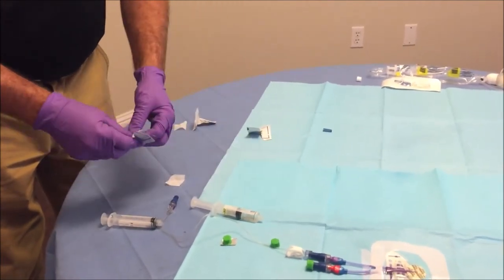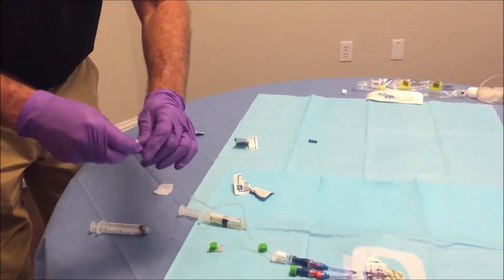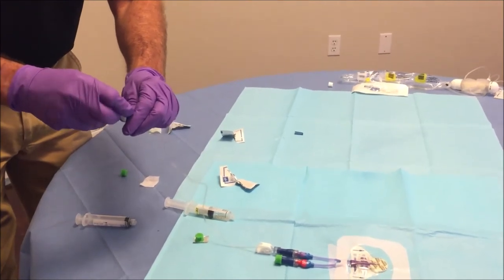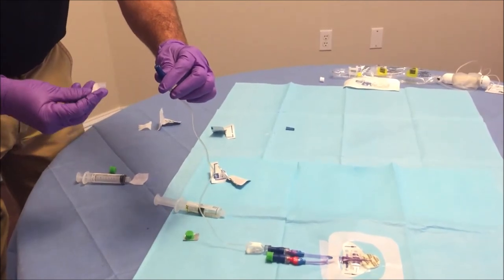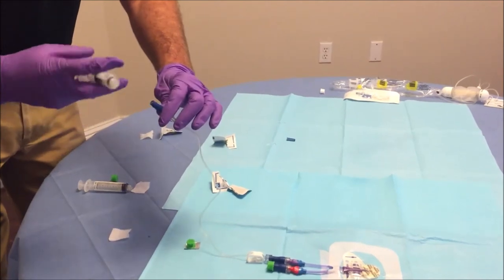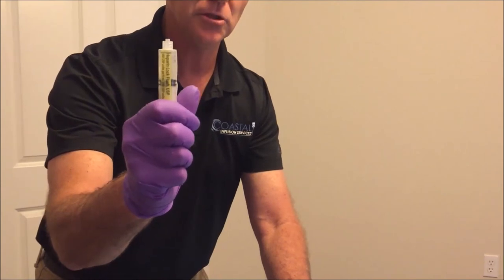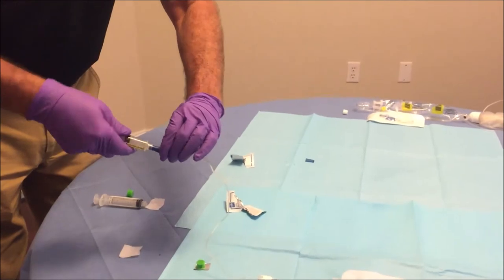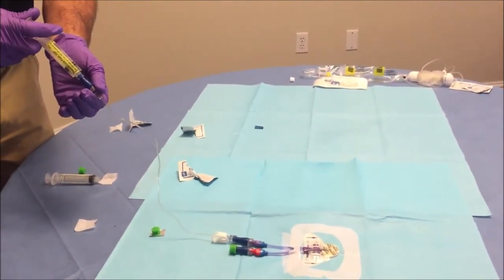At this point, swab the tip of the clave for 20 seconds and allow it to air dry. Remove the air bubble from your heparin syringe by gently pushing the plunger up from the bottom as you did with the saline. Connect it to the port and push continuously until infused.